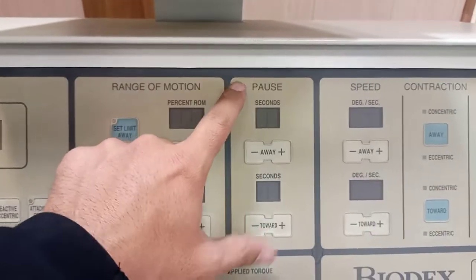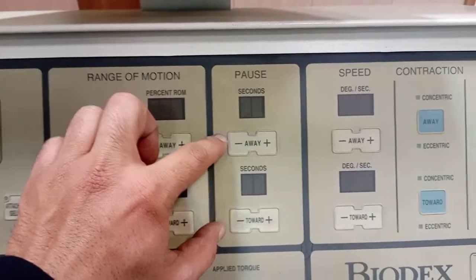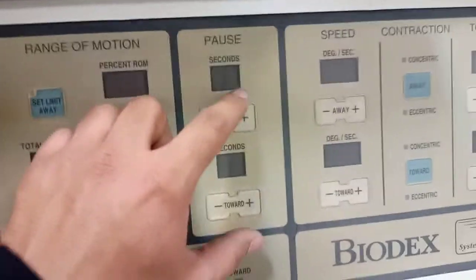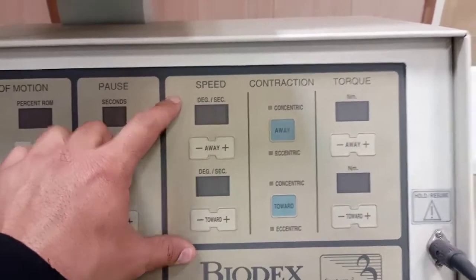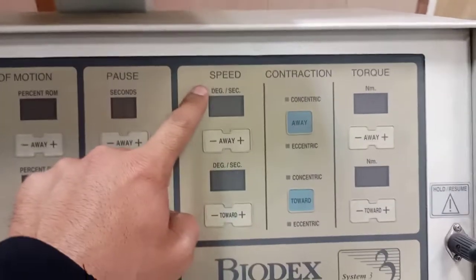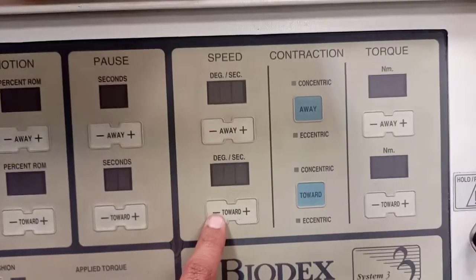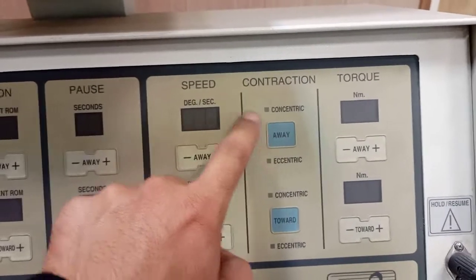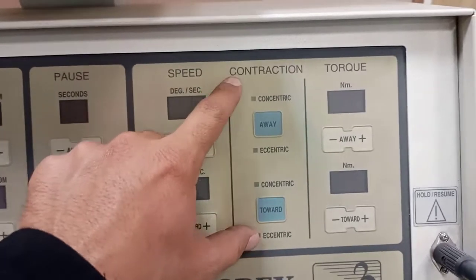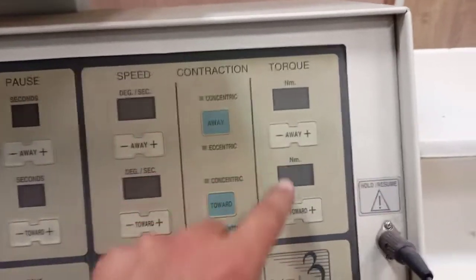This control panel allows you to set the pause in seconds between flexion and extension or between different movements — this is for away and this is for towards. You can increase or decrease the time. The parameters for speed, contraction, and torque are here. You can increase the speed of movement in degrees per second. Away means extension and towards means flexion in our example. We can also work on concentric, eccentric, or concentric-eccentric depending on the setting established. You can also set the maximum torque in extension or in flexion.